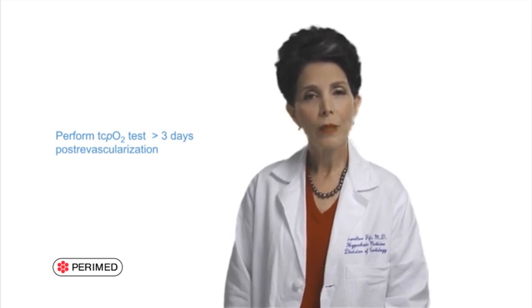However, the increase in baseline pressure values after revascularization may be delayed, so post-revascularization tcpO2 studies should not be performed until at least 3 days after the procedure, and preferably more than a week. The reason is that tcpO2 values can continue to increase for as long as 28 days after revascularization.